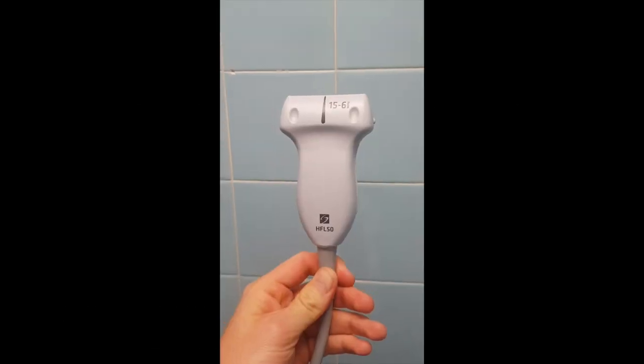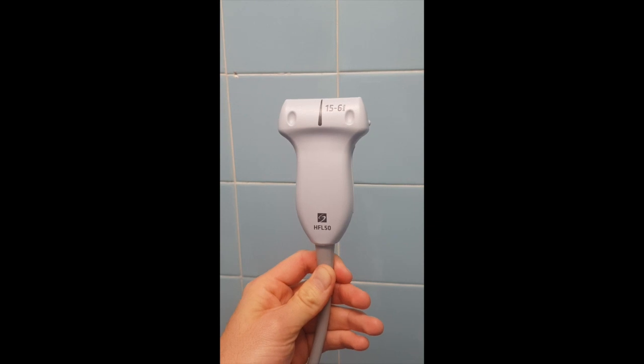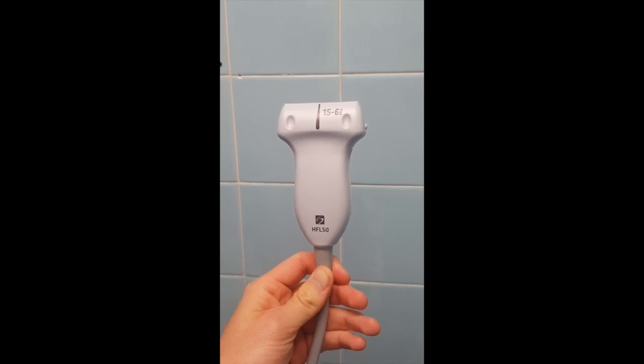In this video we will look at the surface anatomy for the suprainguinal approach to the fascia iliaca block. The block should be performed using the high frequency linear probe.